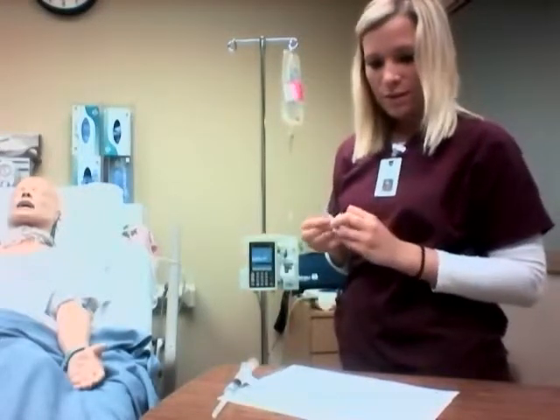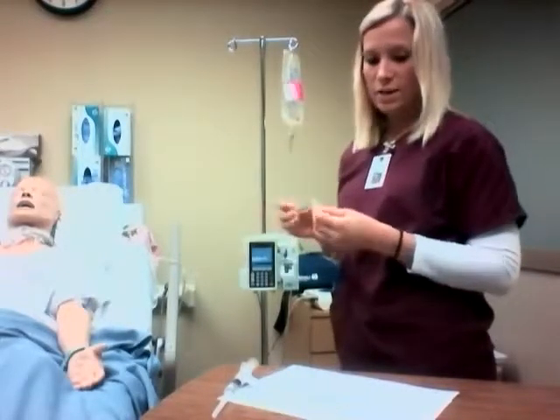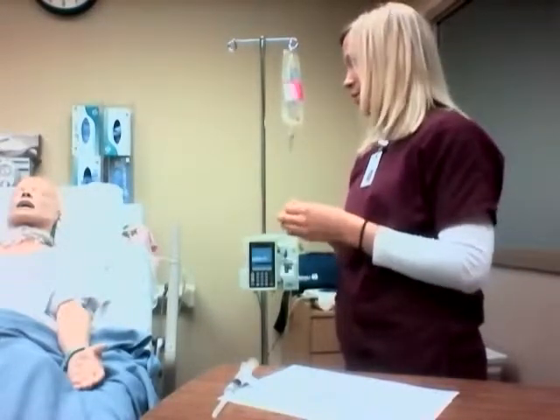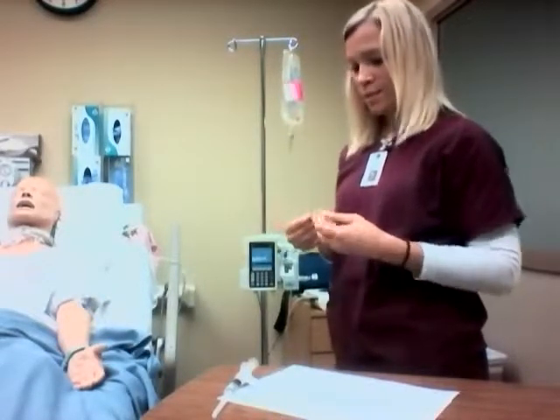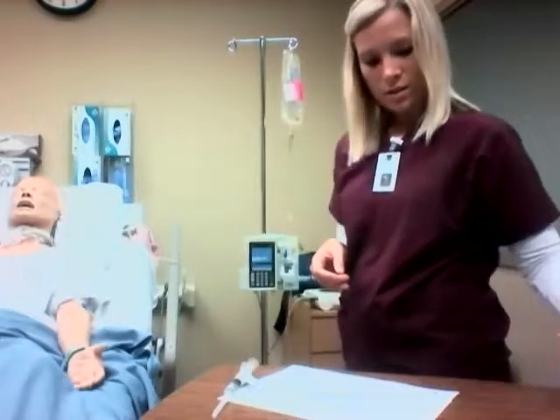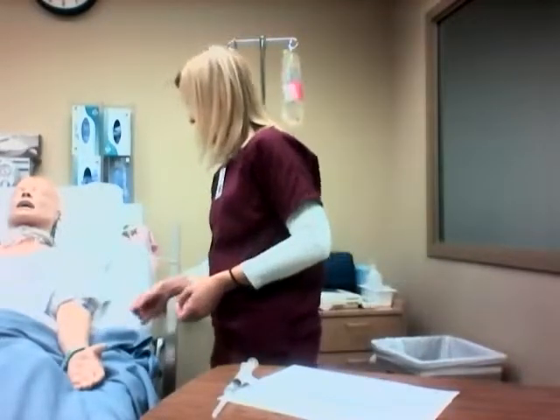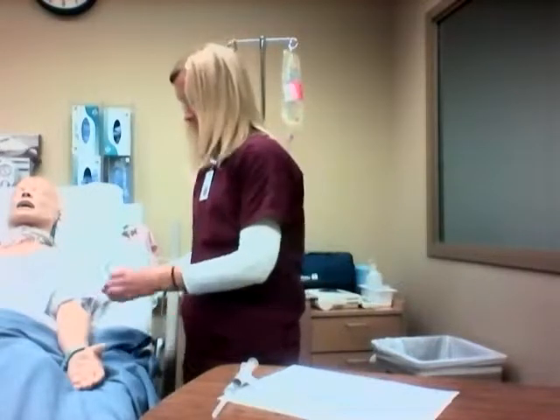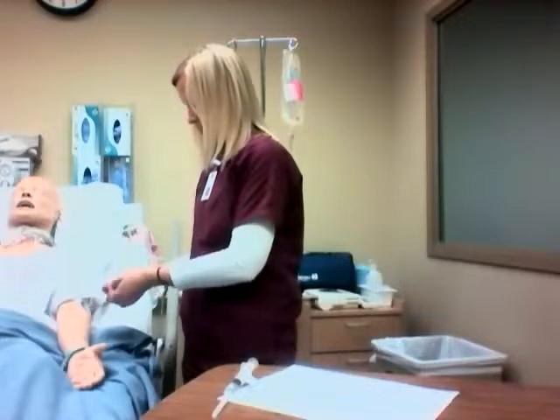And Mrs. Smith, if at any time when I'm giving you this medication or afterwards you start to feel any chest pain, dizziness, shortness of breath, or dry mouth, please let me know right away, because it could be a sign of a reaction to the medication. So I'm going to go ahead and find the Y port, and I'm going to clean the hub for at least 15 seconds.